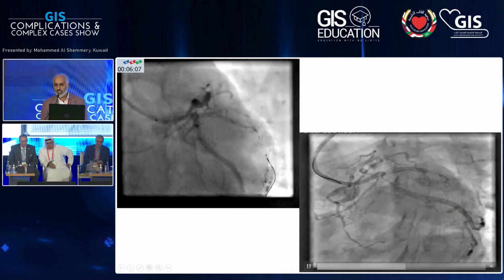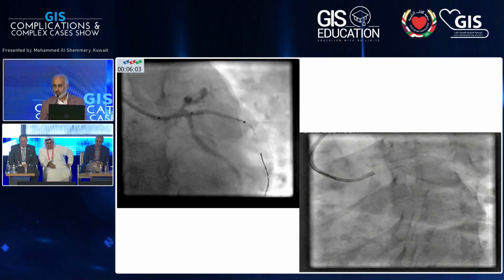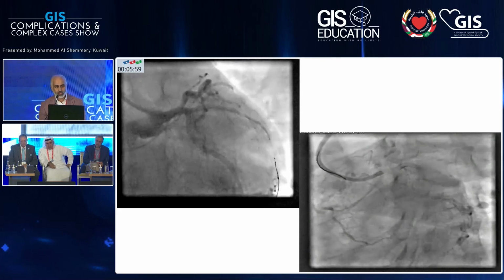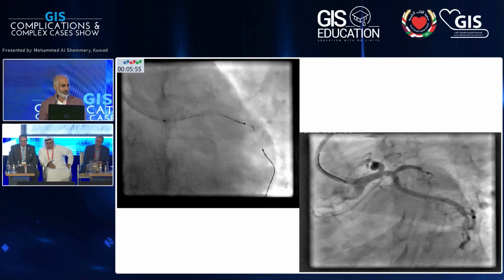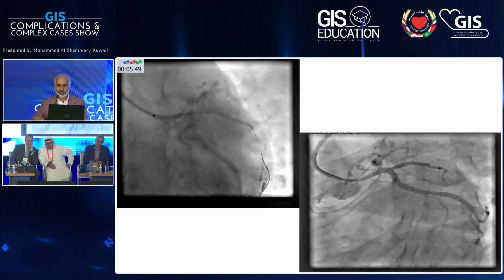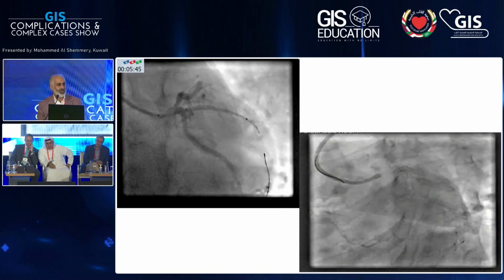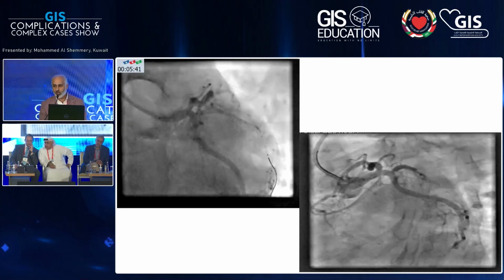She was hemodynamically stable. And the decision here is whether to immediately go and seal this perforation or whether we should just wait. So just a yes or no question by maybe, if I'm allowed, a show of hands. Who would observe this patient? If you want to raise your hand. Nobody. Who would want to immediately embolize it with fat or coil it?